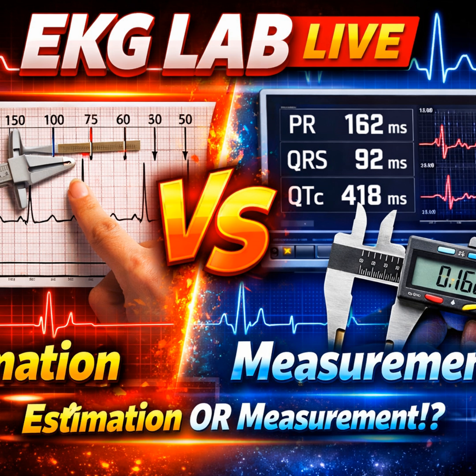Let's look at that Mobitz type 2 block again. You're talking about measuring boxes to find a dropped beat. I am telling you that in a clinical setting, a Mobitz 2 pattern screams danger. It is a visual pattern of a sudden drop without prior warning. But how do you distinguish it from a non-conducted PAC? You look at the patient. This is where the grid fails and the body speaks.